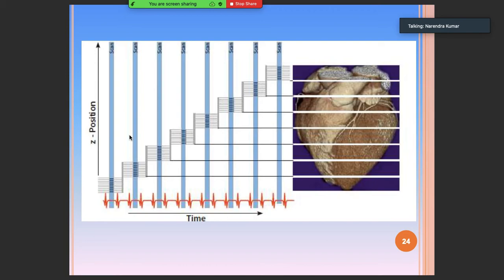So one is 3 previous RR intervals, the other one is 5 previous RR intervals. Filters are actually used for prospective estimation of the position of the following RR waves. So as I said, for 3 previous RR waves it will be mean filtering. Median filtering is applied for 5 previous RR intervals, okay?